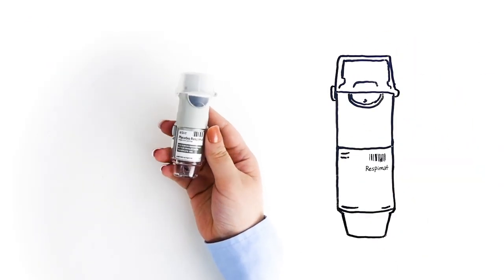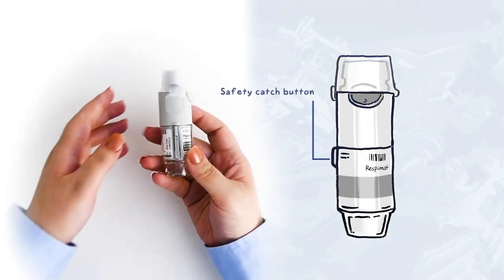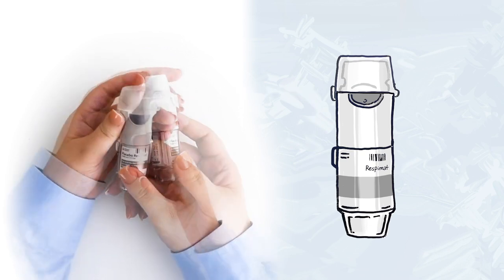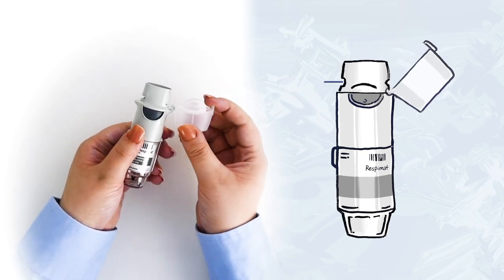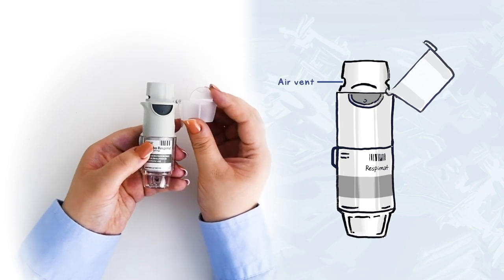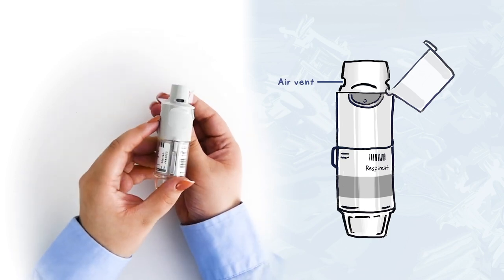The safety catch button along the side allows the clear base to separate from the top of the inhaler. Pushing up on the cap's opening tab reveals the mouthpiece. Along the sides of the mouthpiece are two air vents. Be sure not to cover these when using the inhaler.